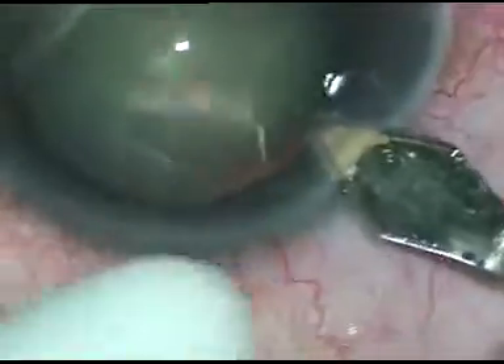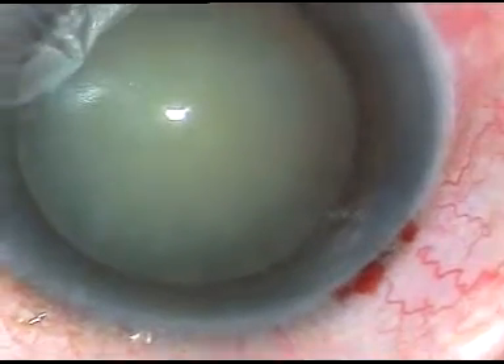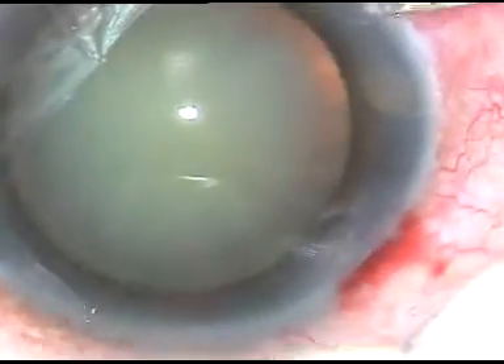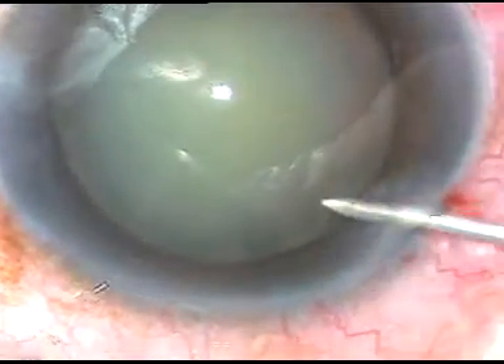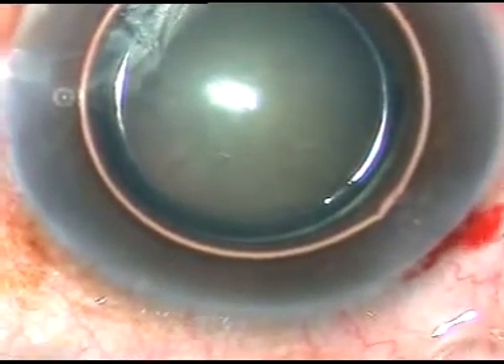Dear colleagues, this is an unedited phacosurgery of a soft mature cataract. By this time, the main incision has been made at a selected site. One paracentesis incision is made on the right side of the main incision, and a big air bubble is injected into the anterior chamber.